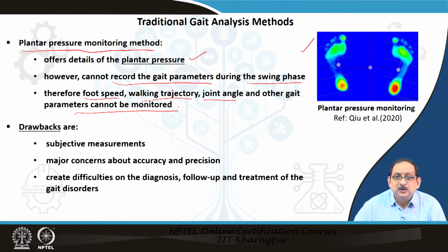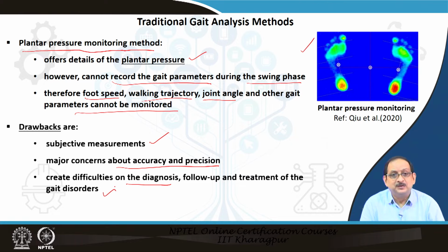Let us come to the drawbacks of this plantar pressure monitoring method. It is purely subjective measurement, which raises major concerns about the accuracy and precision, and it creates difficulties in precise diagnosis, follow-up and treatment of gait disorders.